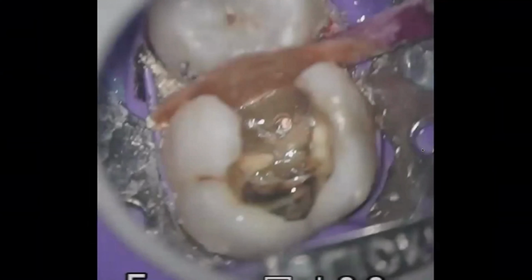So here you could see I did end up placing some Cavit at the base, but I'm using the copper as a good way of wedging and sealing that margin so I could perform an immediate dentin seal in that deep box. So that's what that would look like, and I recaptured the contact there.